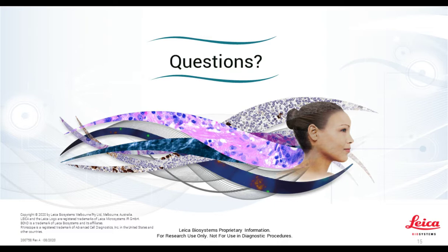So, Andrea, can you do IHC or IF on the Leica together with RNAscope? Yes, hi. The answer is yes, you can. We generally do RNAscope first, and then we do immunofluorescence or immunohistochemistry. And yes, you can do both in an automated fashion on the Leica BOND.